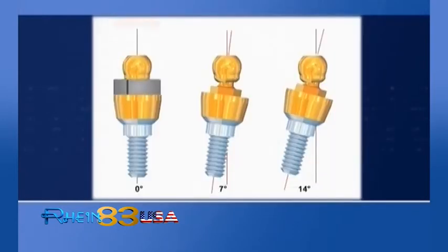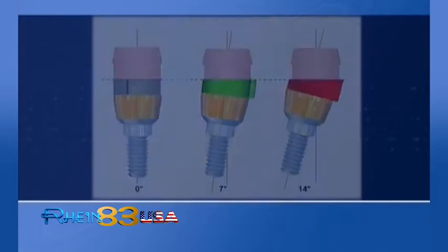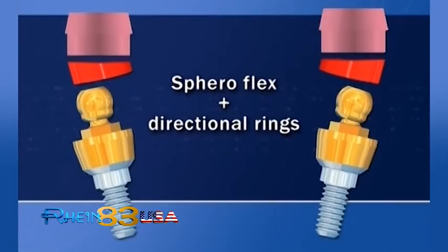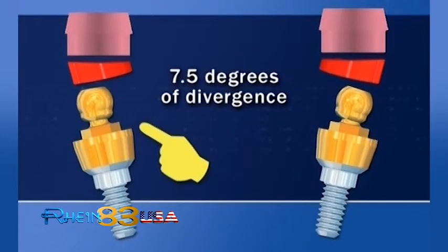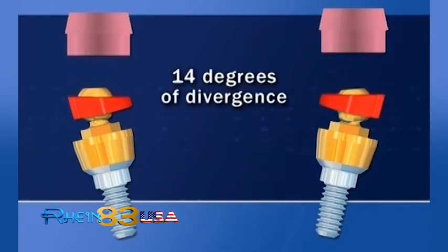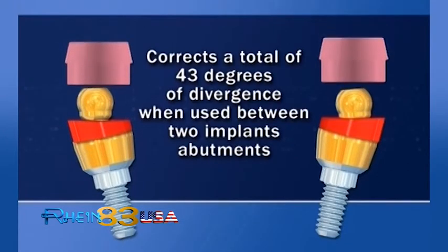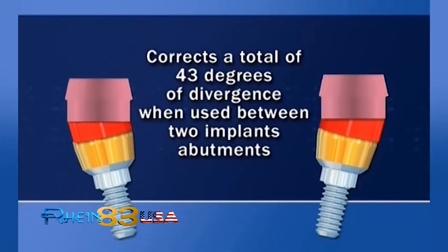The animated sequence illustrates positioning of retentive caps in parallel respect to divergent implants. SpheroFlex plus directional rings corrects up to 7.5 degrees of divergence, or up to 14 degrees with directional rings inserted, and up to 43 degrees in total when used in a two-implant case.